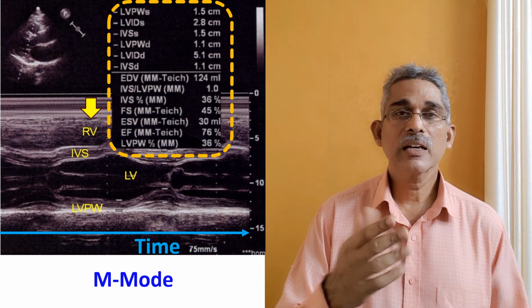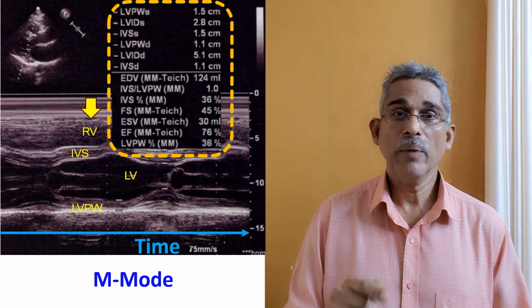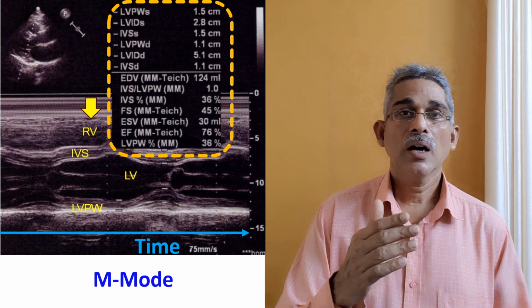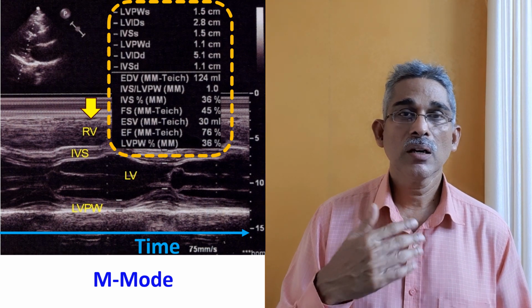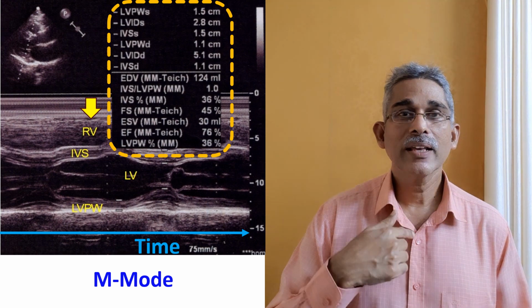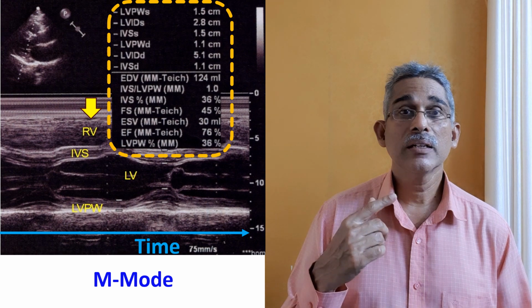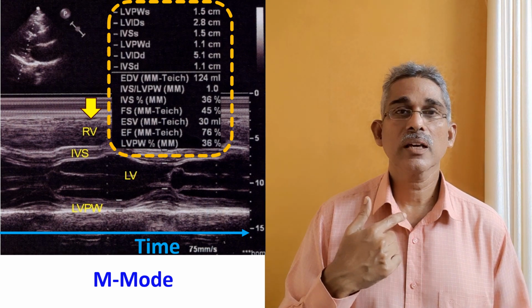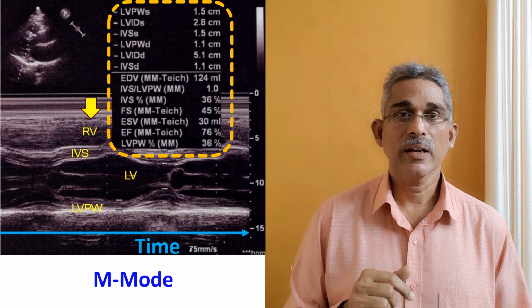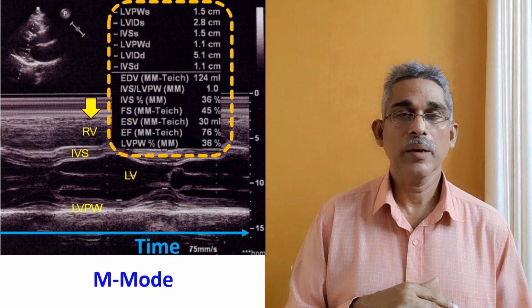Typically, it might send for 1 microsecond and listen for 999 microseconds. And then the next pulse is sent out. So, when you receive the echoes, from the time elapsed between the signal sent and when the actual echo is received, you can find out the distance from the surface or the location of the probe. That is how the images are obtained, and it is computer synthesized so that you have a two-dimensional image.